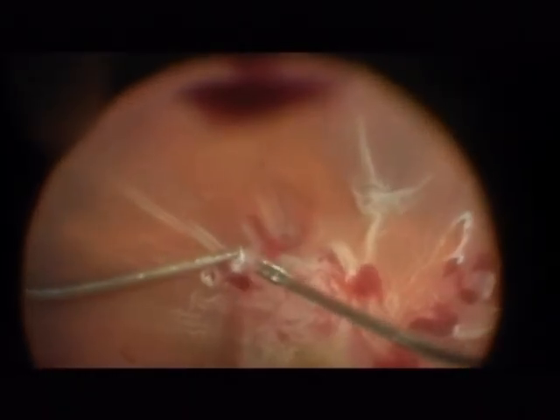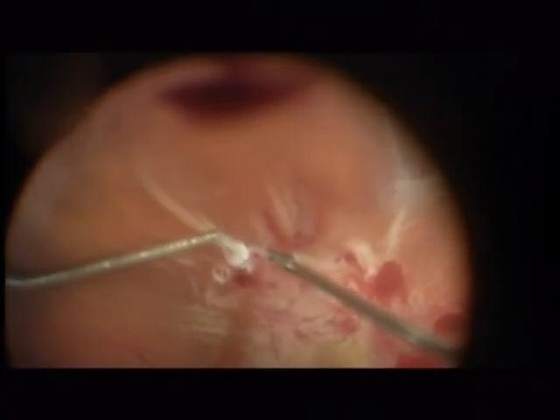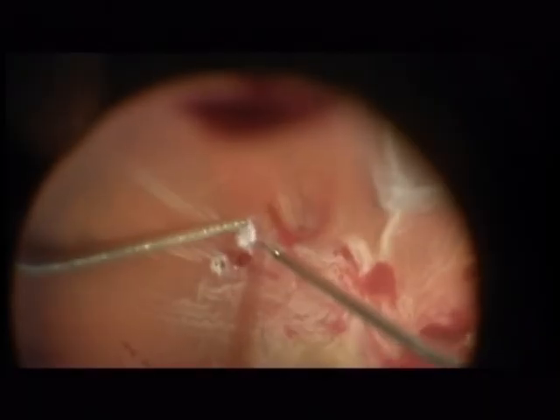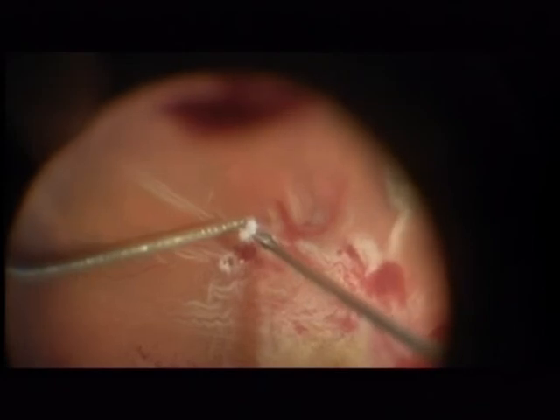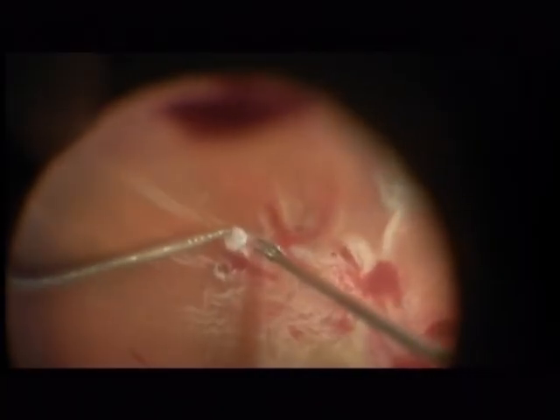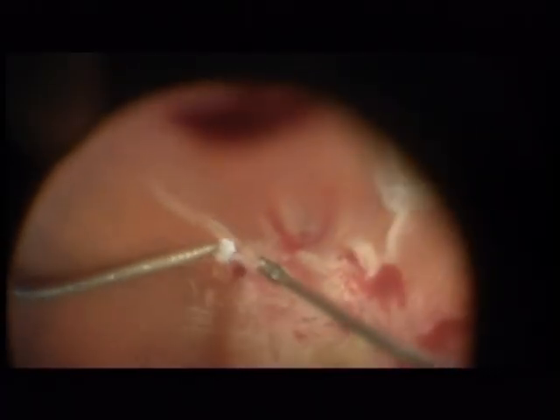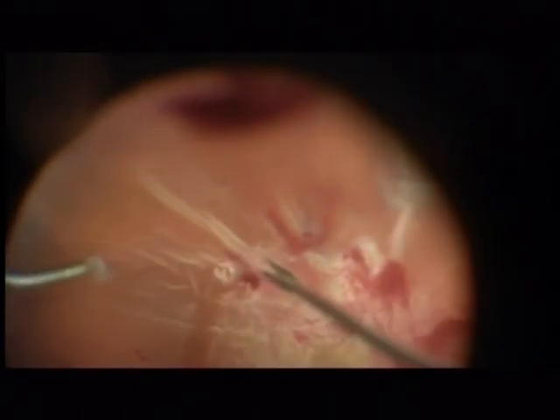I decide to remove this small membrane. Again, this membrane can be left because it does not cause any traction. I am holding up the membrane with the back flush cannula — there is no forceps in the left hand, only a back flush cannula aspirating the membrane and at the same time fixating it. It is a very nice technique: instead of using a forceps, use a back flush cannula.